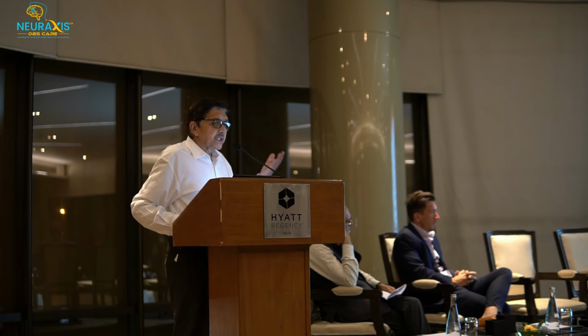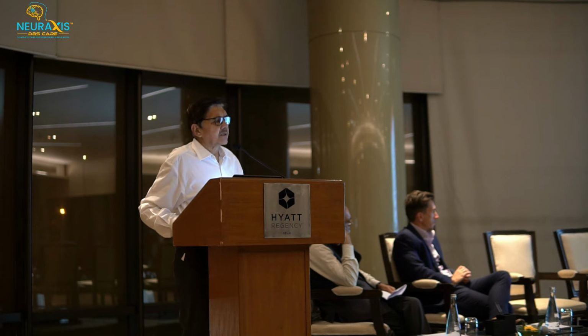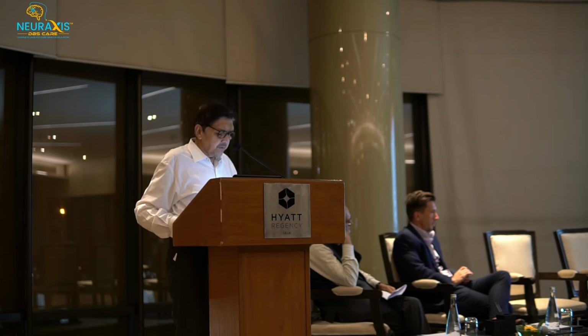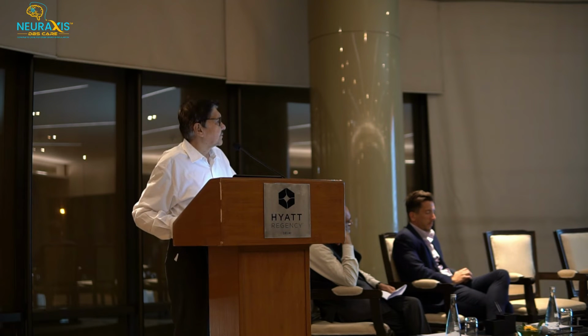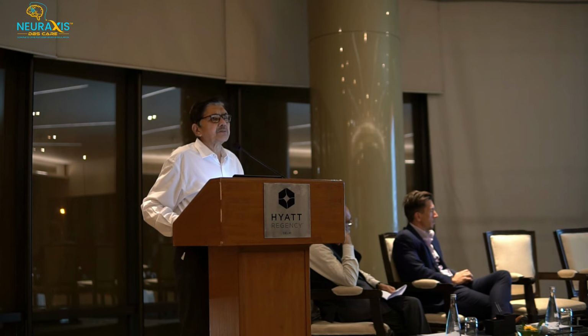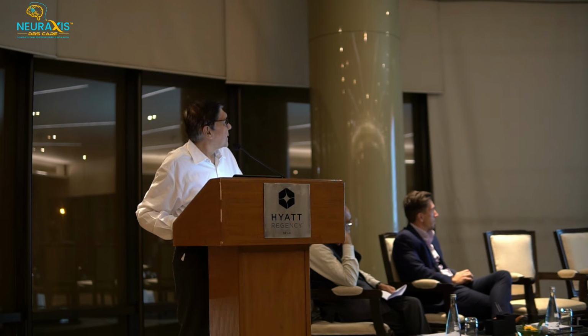Initially the patient has to visit, say, after 1 week of the discharge, then after 1 month, then after 3 months, and finally it all depends upon how the patient is behaving. He can visit the neurologist and neuromodulation specialist. Yes, there are different kinds of batteries. Some are for 5 years, some are rechargeable, some are non-rechargeable. Now we have 15 years battery, 25 years battery. There are many types of electrodes, but this I think is beyond today's topic.